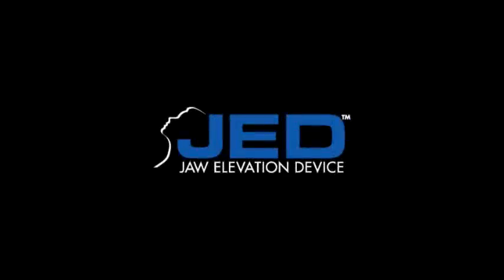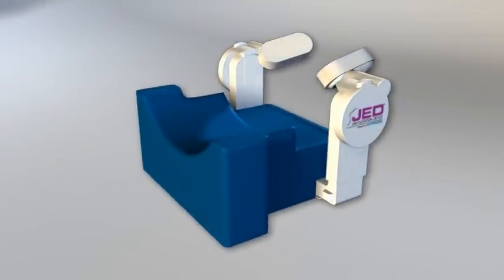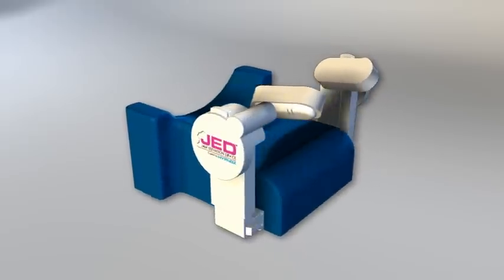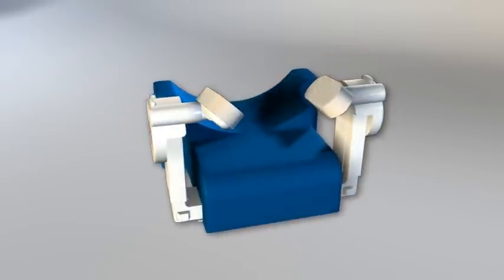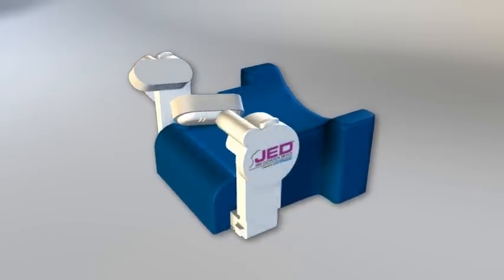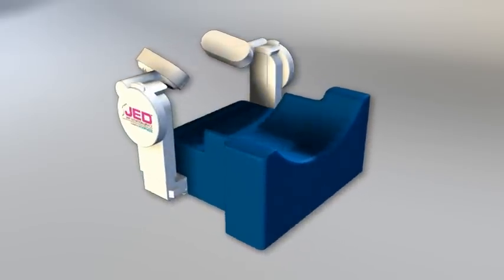The JED jaw elevation device is a new hands-free solution for sedation cases. The device assists the provider in maintaining an open airway during any procedure in which the patient is sedated and the airway may become obstructed. The JED performs jaw thrust, eliminating the need for the clinician to manually maintain jaw thrust during the procedure.